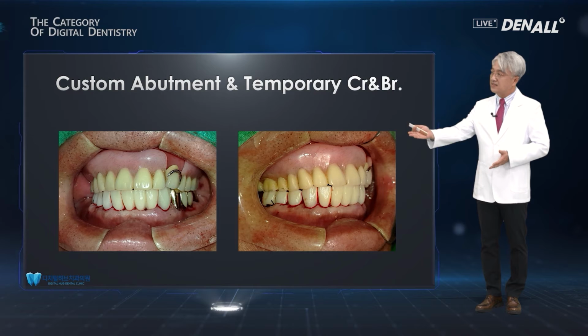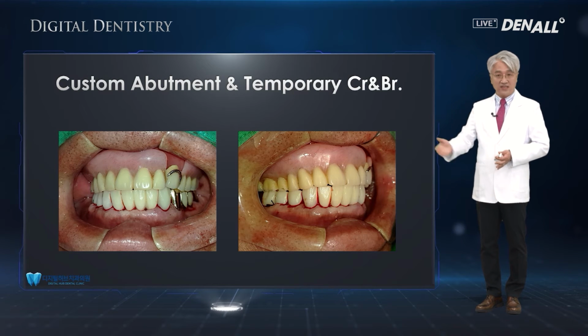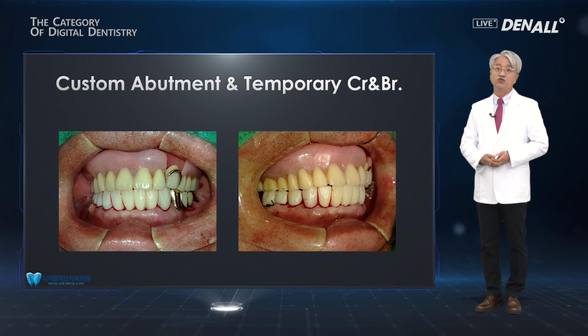So we set it up to the patient, and before we do occlusal adjustment and margin fit, the quality and occlusion are all good. So with digital dentistry, this type of quality is now available even today.